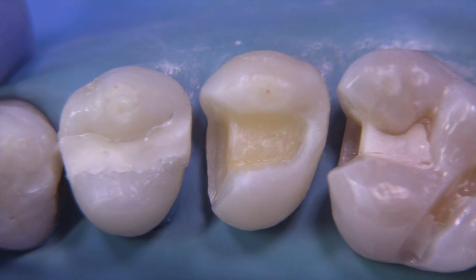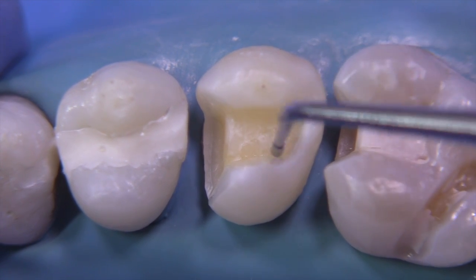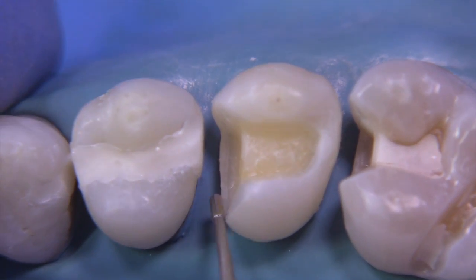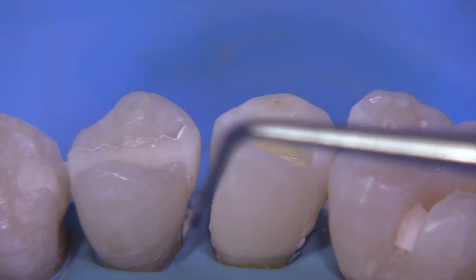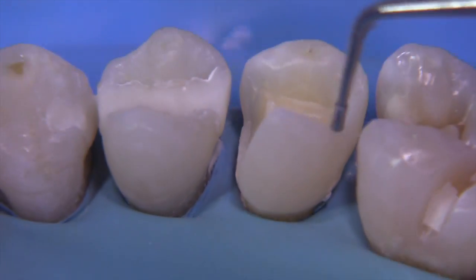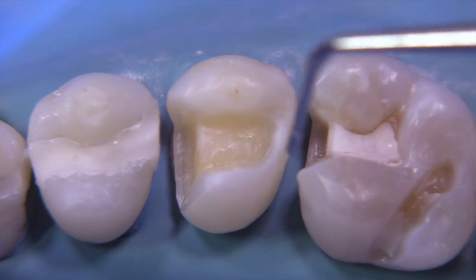We try to use the burr as much as possible — there's been no hand instrumentation on this preparation at this point; this has all been done with the burr. I want to thank my mentor, Dr. Warren Johnson, who really taught me to use the burr to define your preparation and then use the hand instruments to refine. Notice how the lingual cusp tip is encroached upon by that lingual extension. That's not a really good idea to leave a margin up in that area where there's going to be a lot of function.